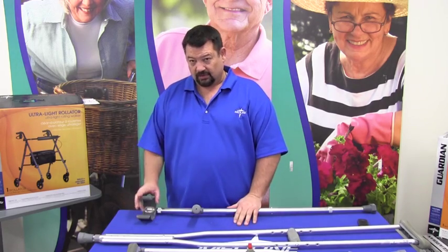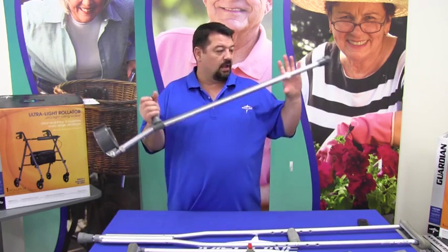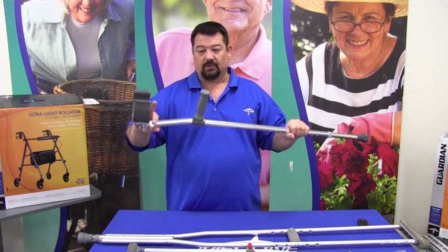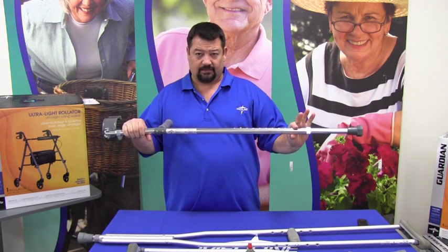Forearm crutch, this is the cuff, this is the hand grip, these are the tips, adjustable collar, push button height adjust, push button height adjust.